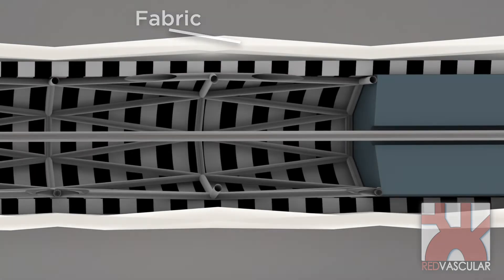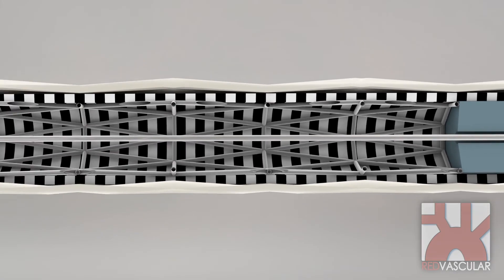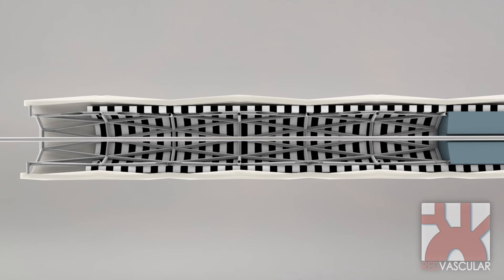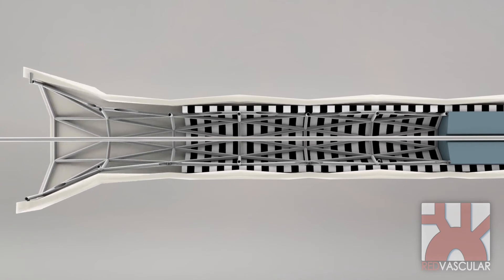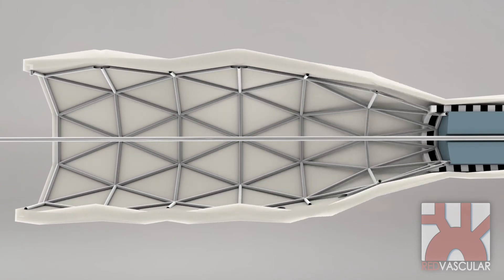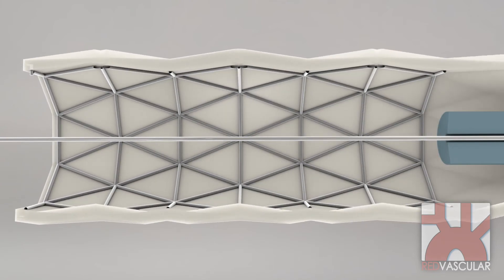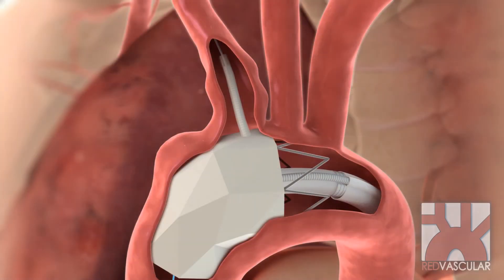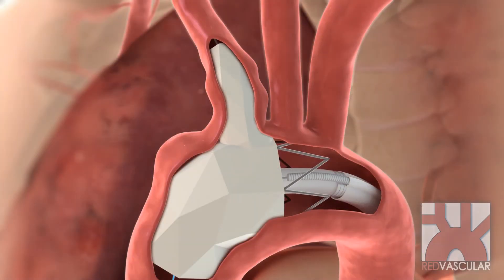As the branch sheath is retracted, the branch stent self-expands along with the outer fabric. Here, the branch graft expands as the branch sheath within is retracted.